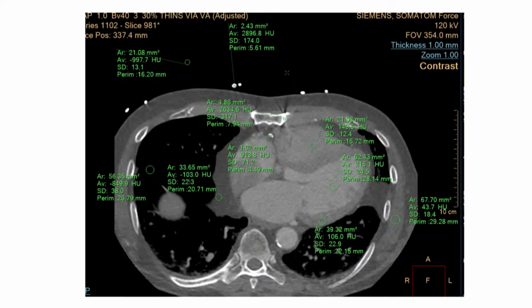This is a typical example of a contrast CT throughout the chest. The air in the upper left corner is negative. The region of interest electrode, which is metal, has very high attenuation of almost 3,000. The fat tissue surrounding the heart has attenuation around negative 100. Contrast given to the patient inside cardiac cavities is about 200–300 HU, and the myocardium with contrast is about 100 HU. That's how we perform tissue characterization with CT — distinguishing between calcium with high density and fat with negative Hounsfield units.